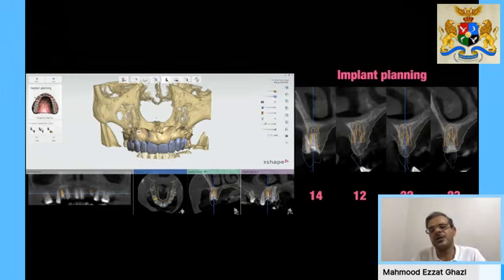prosthesis. Then we started to do the smaller adjustments that matter, seeking screw-retained restorations, because this is, of course, more favorable, as we all know. Am I going to be able to do this in the anterior and the posterior area both? We were able to do this in the posterior area, no problems. But in the anterior area, it was very difficult.